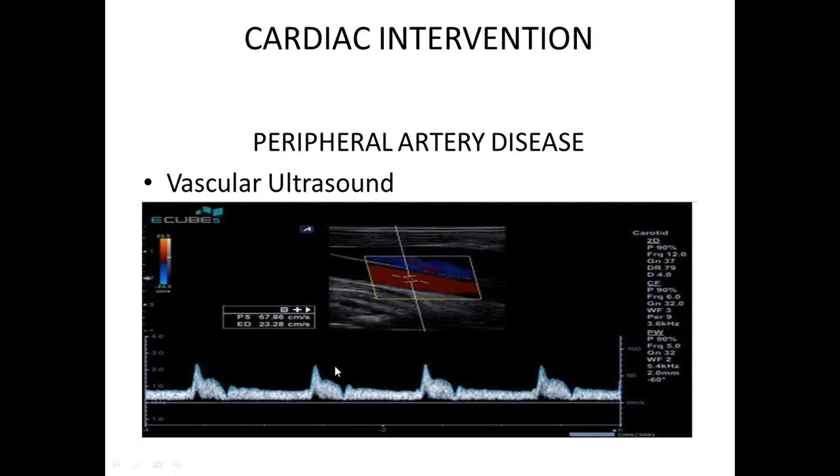You have a systolic component and a diastolic component. So again, just like we do with any ultrasound technique, you need to have your ECG. Remember, it's gated, so you're going to have systole and diastole. With your central arteries, the arteries going to the brain, you'll have a prominent systolic and a diastolic component. Okay? And we'll show you the difference when we talk about a pure peripheral artery.